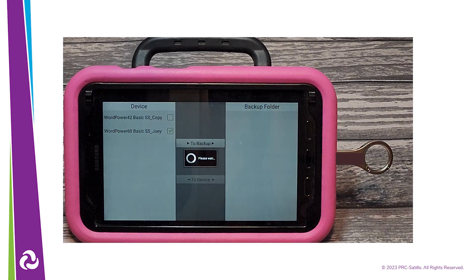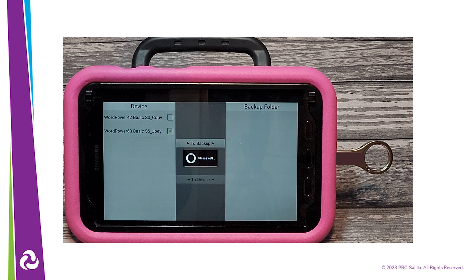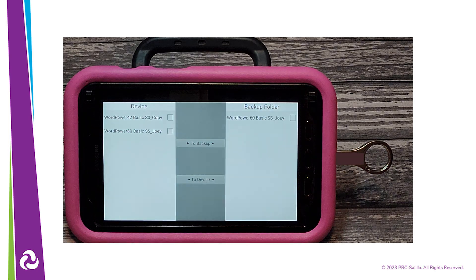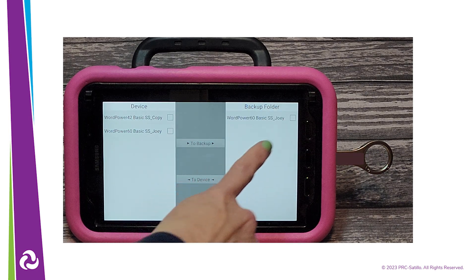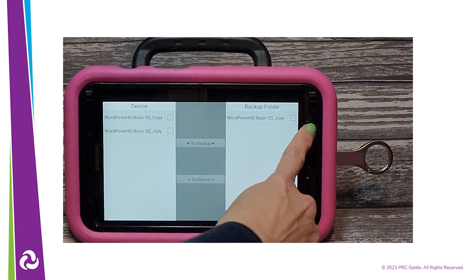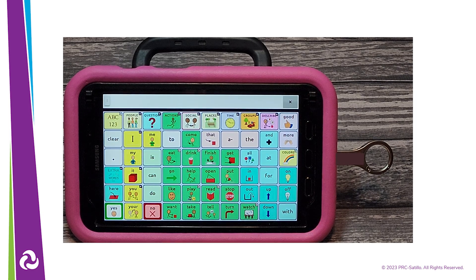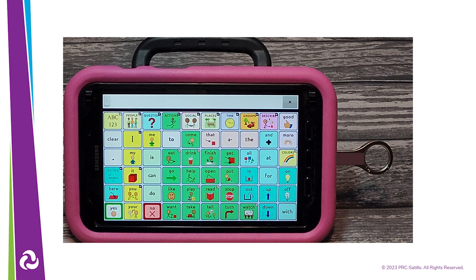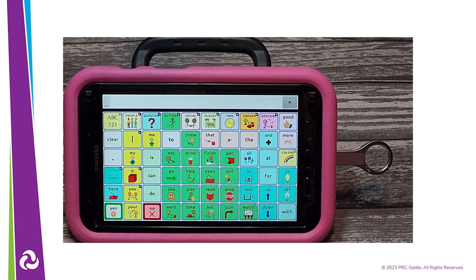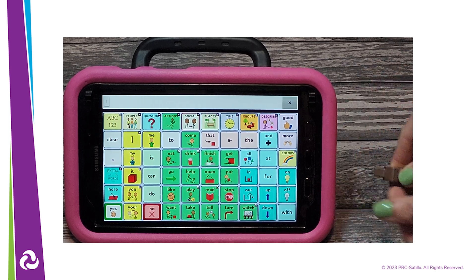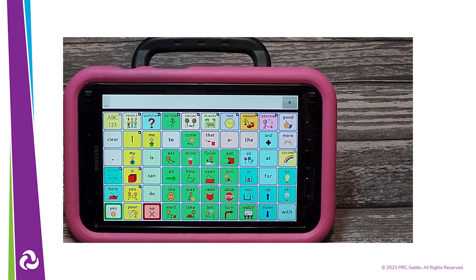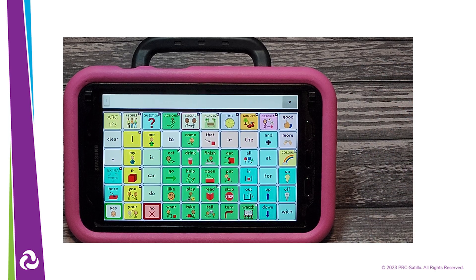Select the file you want to backup from the device, then tap on the To Backup button. The vocabulary file has now been backed up to the dual USB and will be visible on that side of the screen. Press the Go Back button on the NovoChat until you are back to your vocabulary file. You can safely remove the dual USB from the NovoChat.